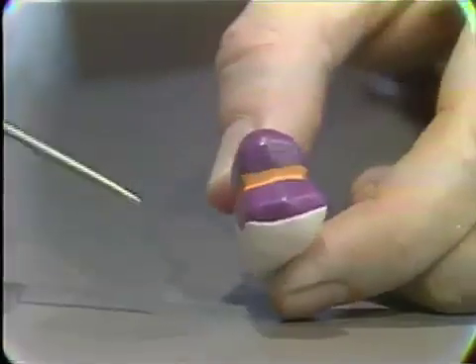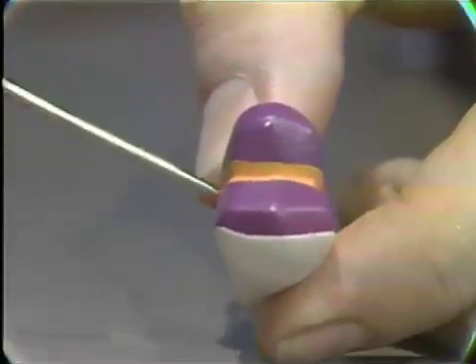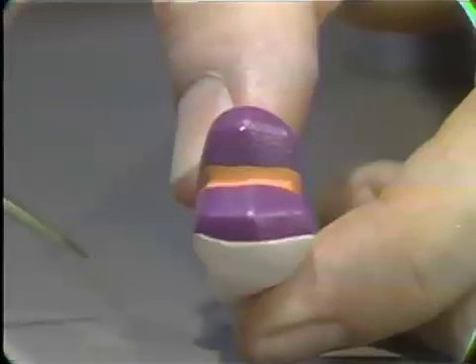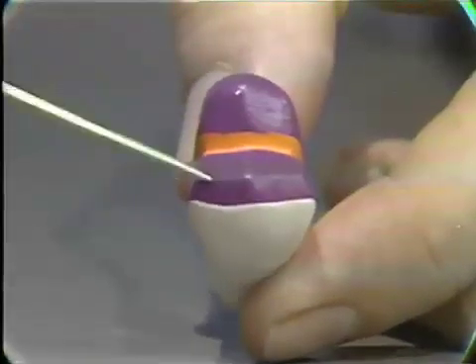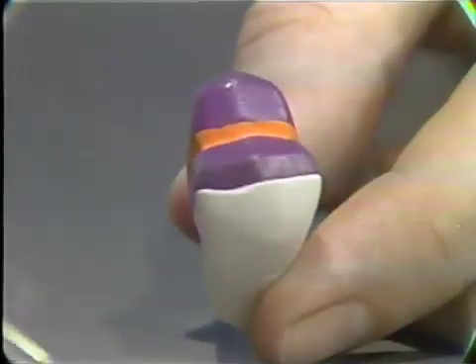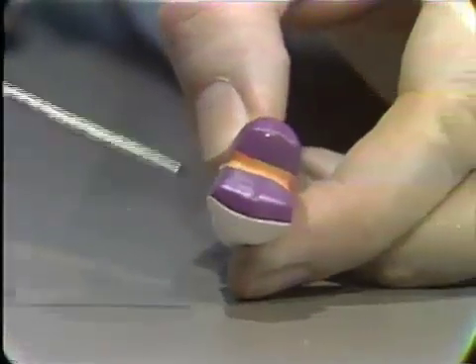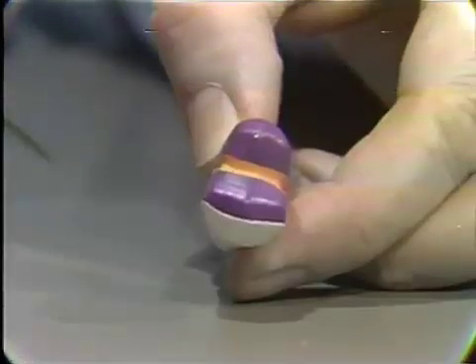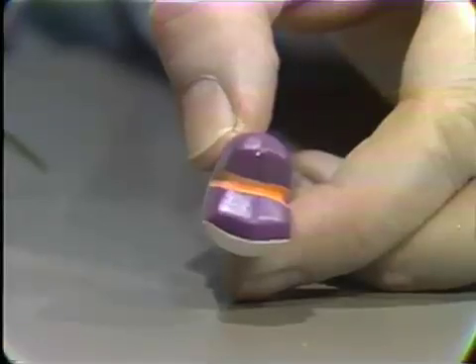As we have seen earlier in the diagram, it's the length of these grooves on either side and the degree of taper, the minimum degree of taper of these, that gives the essential strength to this type of preparation. You can see that the whole of the occlusal surface is covered and is protected right up to the margin of the buccal cusp along here. This then is the most conservative type of three-quarter crown with groove retention on the proximal and across the occlusal. It has slices on both the mesial and distal surfaces and is excellent for use on a tooth which has no previous caries or restoration.